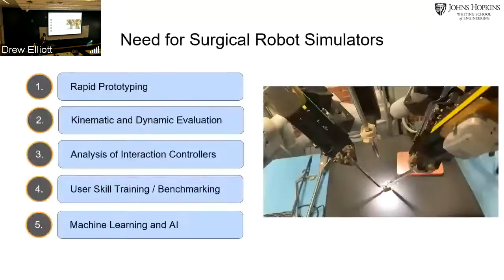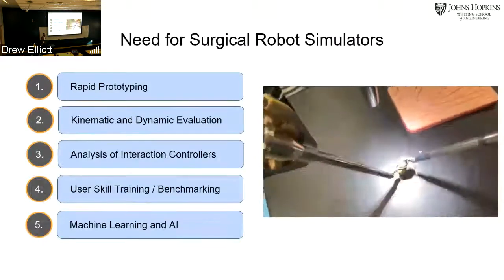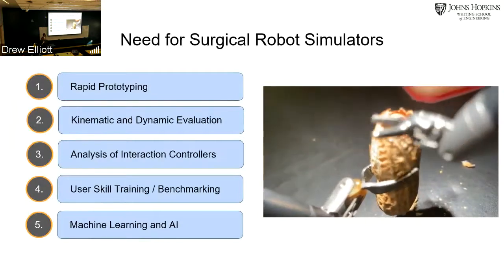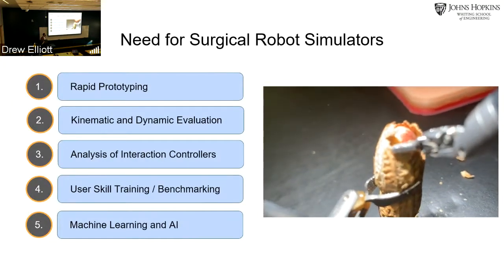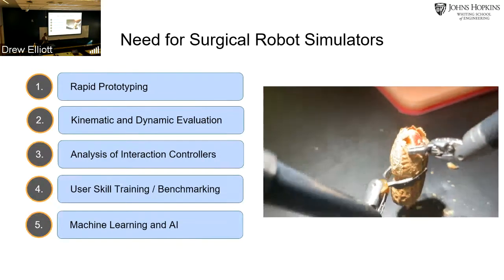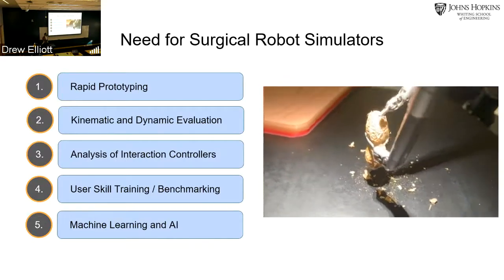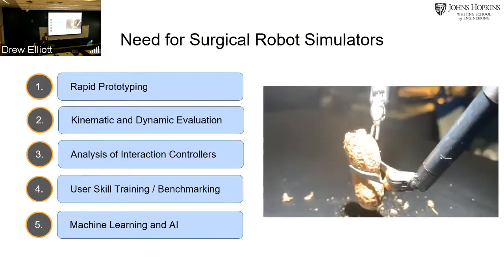Surgical simulators are useful because they allow rapid prototyping of design ideas, kinematic and dynamic testing of different robot designs, rapid implementation and analysis of force controllers, user skill training and benchmarking, and last but not least, a very cost-effective way of training machine learning algorithms.